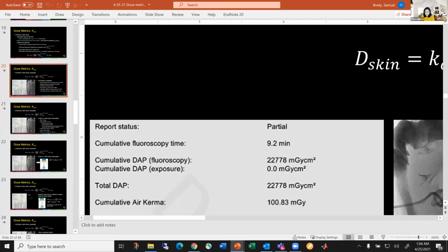We're talking maybe 10, 15 microsievert. It's equivalent to a background radiation dose per day. So it's really low. But if you're getting it every year of your entire life, then you want to make sure the dose is good. You don't want to be overdosing every patient in dental. So though the doses are low in dental, you still want diagnostic reference levels to make sure everyone in Thailand is doing good.